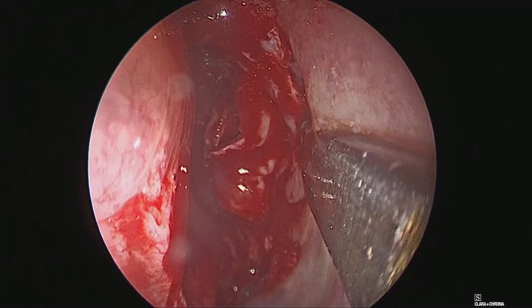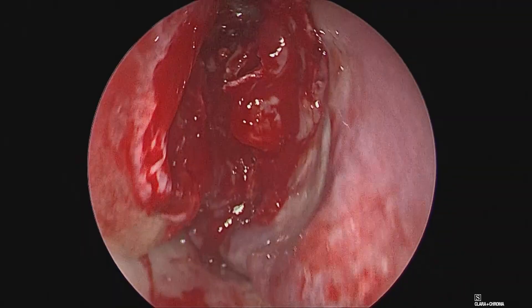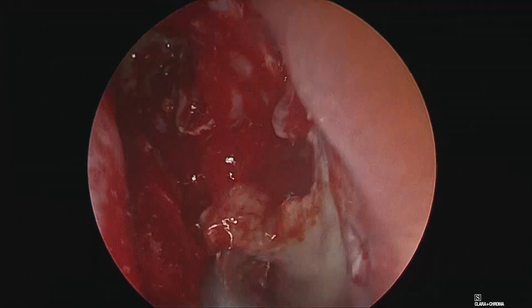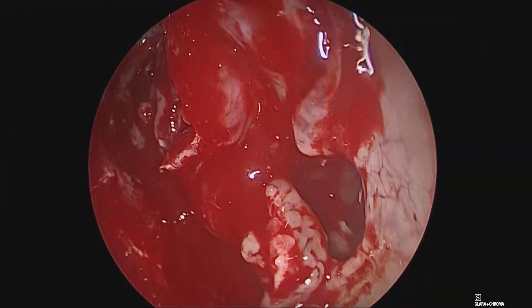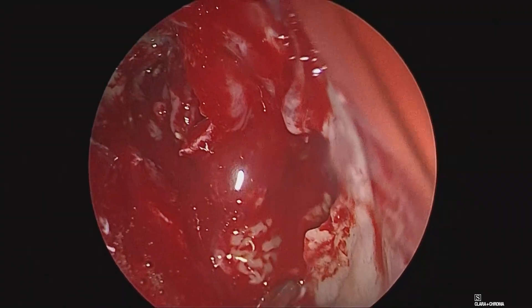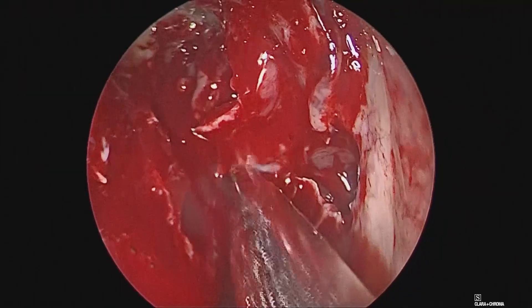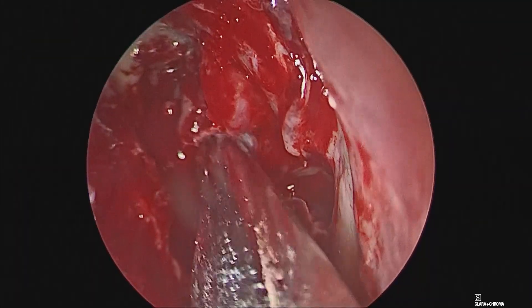The expansion of the fungus has pushed the lamina papyracea shell laterally, creating a wide space on this side. As remarked before proceeding further, we progress to a reasonably wide antrostomy. This is very important because in fungal disease we need a wide antrostomy for good, adequate, high-volume irrigation in the postoperative period using saline as well as topical corticosteroids.